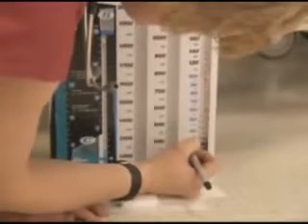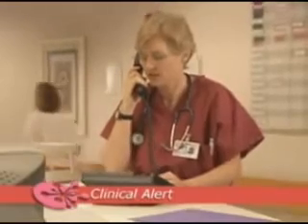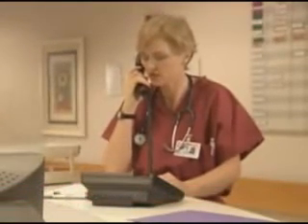Near the drainage chamber, mark the date, time, and fluid level according to hospital policy. Notify the physician if chest drainage exceeds 100 milliliters per hour. Excessive drainage can signal hemorrhage, which may require surgery.